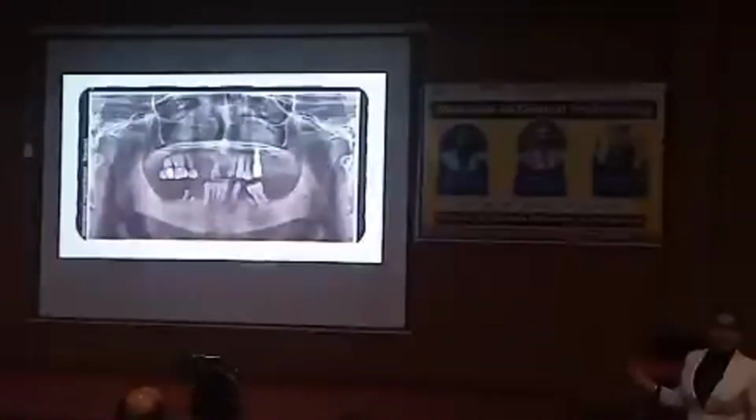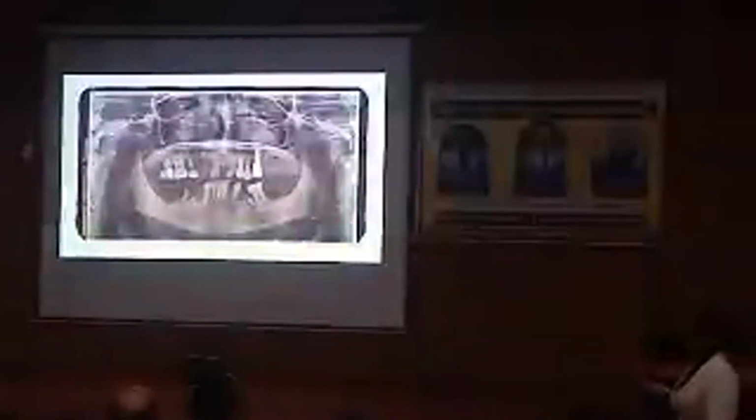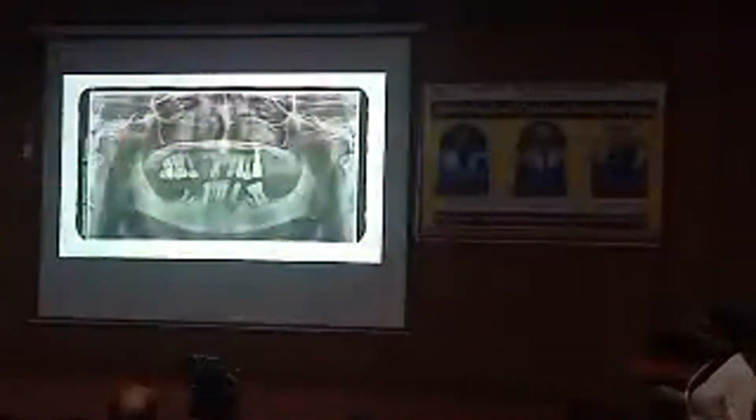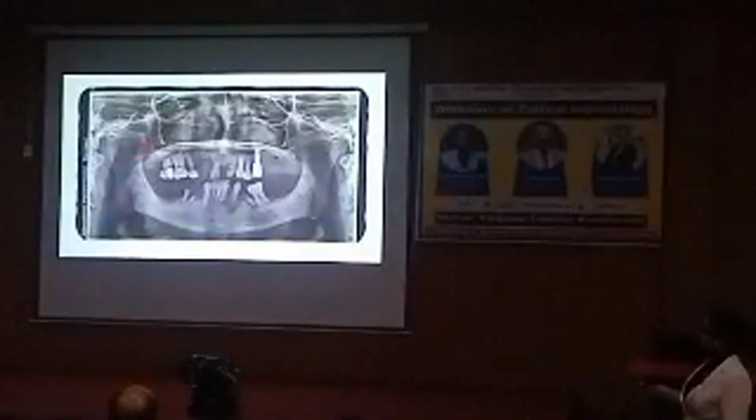Maybe not all of you can identify it yet, but after seeing many X-rays you will point it out with your eyes closed. The basic rule for judging the pterygoid is, we all know the tuberosity. Move beyond the tuberosity, where the distal of your maxilla ends. Here is the fusion zone, and any flat shaped radiopaque thing that you find here is your pterygoid.